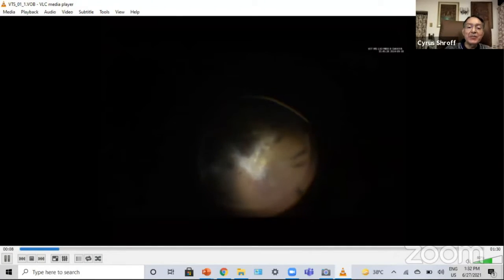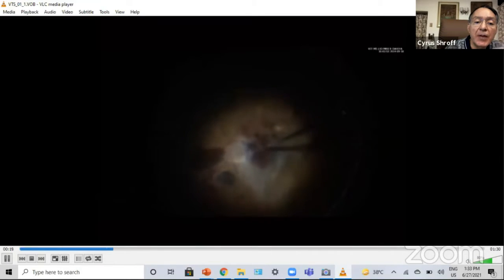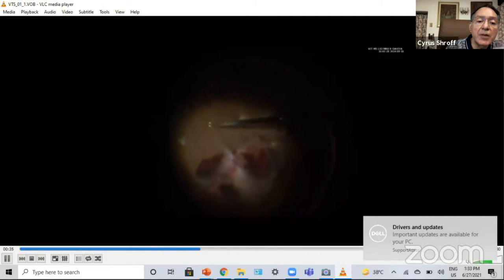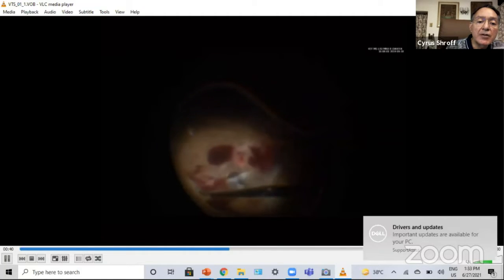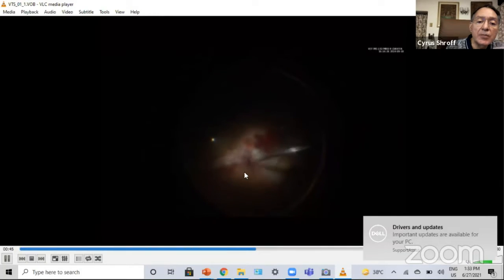We find that the plane in the periphery, we cannot find this. And so we make the incision over the area of the subhyaloid hemorrhage over the macula and between the macula and the disc. And then from there we can extend this hyaloid separation over the disc and see where this separation happens easily. Here it's in the lower nasal quadrant. We can extend this peripherally, the separation, and then almost like a rexis, turn it around circumferentially, and we find gradually this hyaloid is separating from the retina.